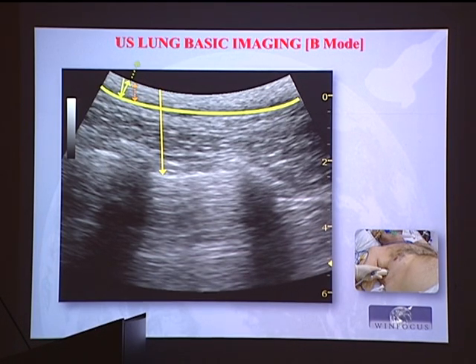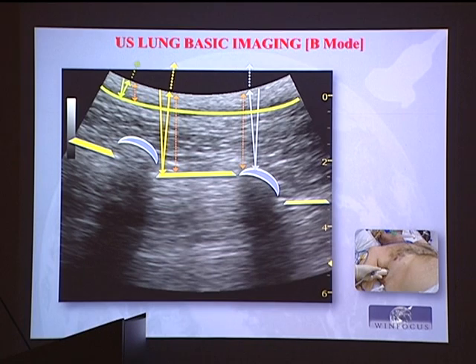And you see that a little bit deeper, there is another interface reflecting, composed by many, many dots, brighter than what is adjacent, and will allow your eyes to recognize other linear structures. Then you will have other interface with different orientation that will reflect a little bit weaker, with a signal that is fading, that will have this kind of representation.